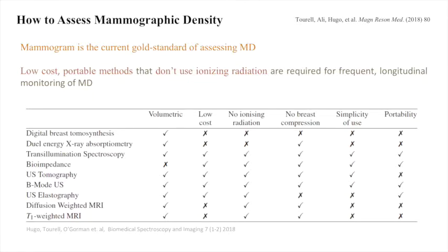X-ray-based mammography is the traditional clinical way of quantifying mammographic density. Computed tomography can also be used as a proper three-dimensional alternative. However, X-ray-based techniques are not always suitable. They're not recommended for young women or women recovering from surgery or women with certain inherited syndromes associated with radiosensitivity or cancer risk. Even in average patients, the maximum recommended mammogram frequency is once every 2 years.